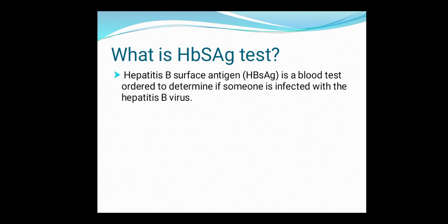The presence of a color line in the test region indicates a positive result, while its absence indicates a negative result. On the other hand, a color line will always appear in the control line region, indicating that the proper volume of specimen has been added and membrane wicking has occurred.